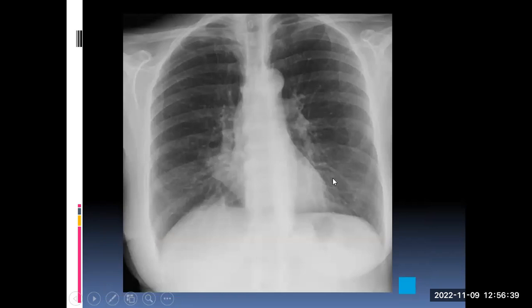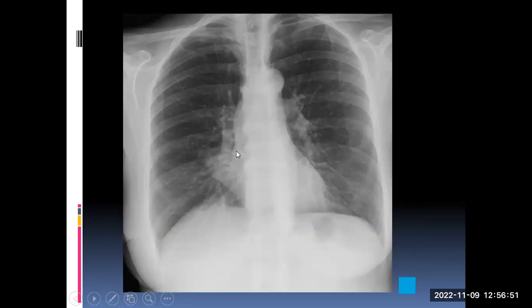This is the right heart border. The heart borders should be very sharp, but here you see a triangular area where the right heart outline is not seen. Using the silhouette sign: what silhouettes the right heart border — immediately adjacent to the same plane — is the right middle lobe. When the right middle lobe collapses, this is what you see. Sometimes it may not be this clear; sometimes you just see vascular crowding.